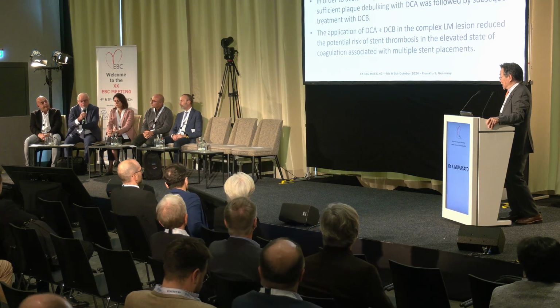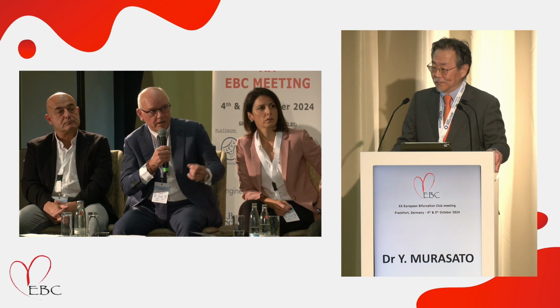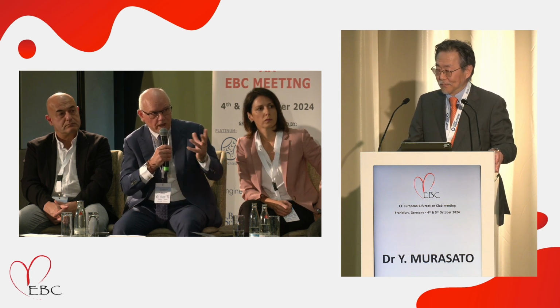Thank you, Yoshi. Fantastic case, very complex disease and combination of stent and DCB. Given that the location of your DCB was left main bifurcation, are you concerned, given that prognostic territory, about a lack of scaffold leading to significant TLR and TLF, beyond drug-coated balloons in smaller vessels and more distal vessels? Do you want to comment on, in the absence of data, DCB in native prognostic vessels without a scaffold?